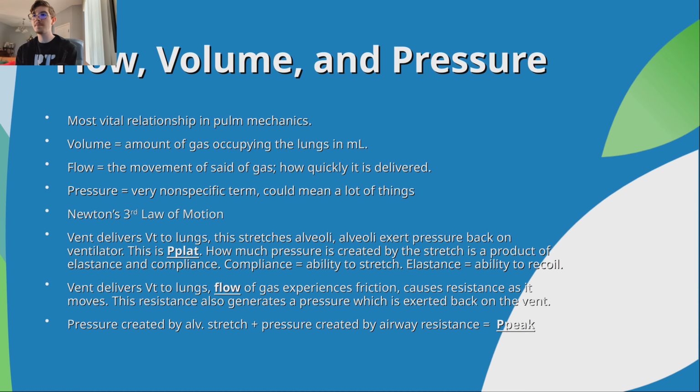But we need to remember Newton's third law of motion. See, you thought I was going to bring up some gas laws here, but I'm not. I'm bringing up just laws of physics, right? Every action has an equal and opposite reaction. I honestly believe that this third law of motion is maybe even more important than the gas laws when talking about respiratory mechanics, right? Let me explain.